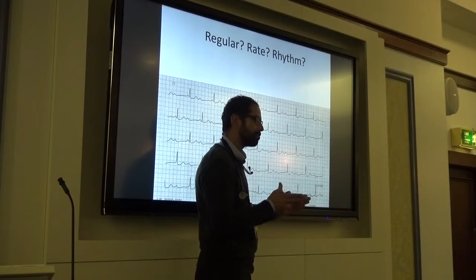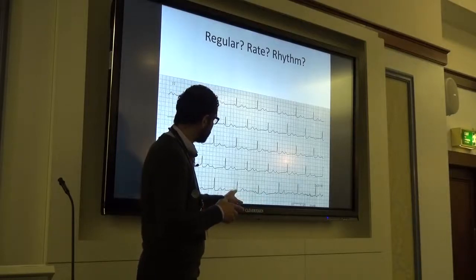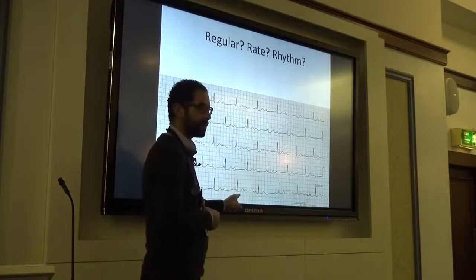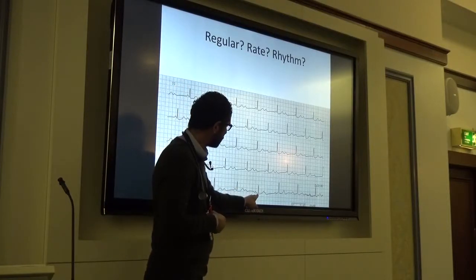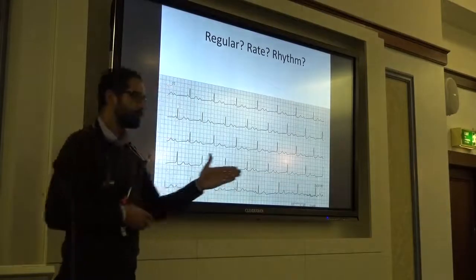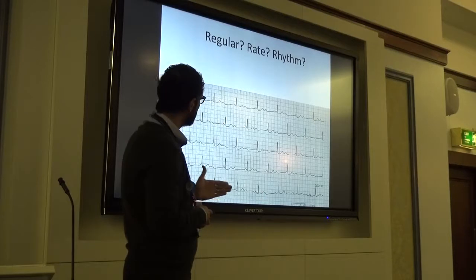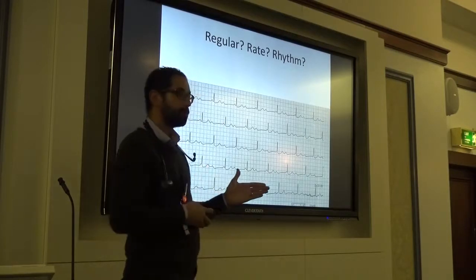Remember this sentence we said, the P wave has to maintain the relationship with the QRSs. Yeah? But here, if you look at just this beat on its own, you can say this is PQRS, yeah? You can say this is sinus. But then you can't see it elsewhere. What's happening with the PR interval here? The PR here is getting in and out. The P wave is not keeping in sync with the QRSs. So what would this be? Complete heart block. Very good.